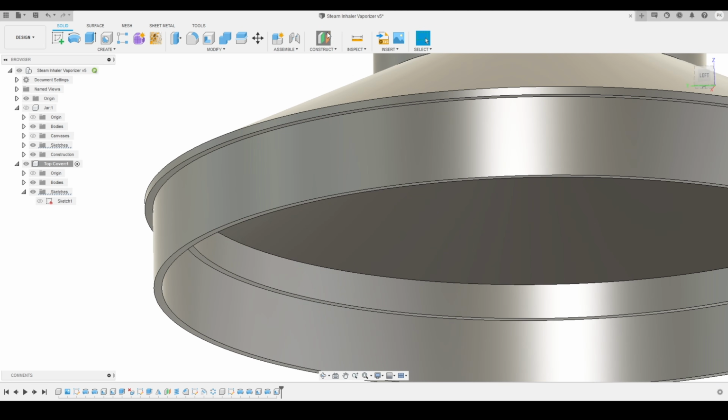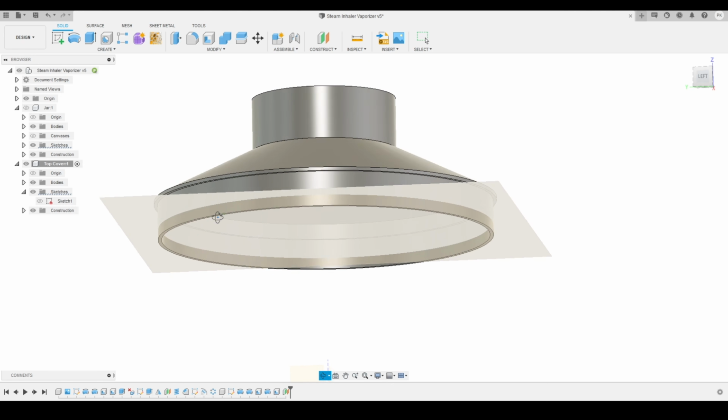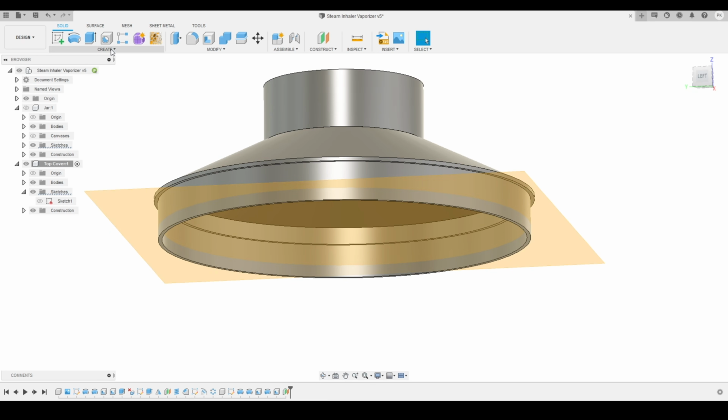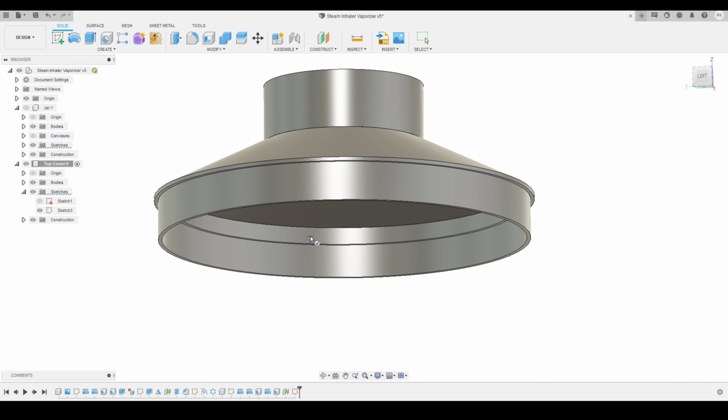Now we'll activate this offset plane tool. We'll select this plane to offset, and we'll give -3 millimeters. So here you can see this is now my new offset plane, and I will go to the create panel. We'll activate the coil tool, select this plane as a sketch plane, and create the measured diameter of our coil.